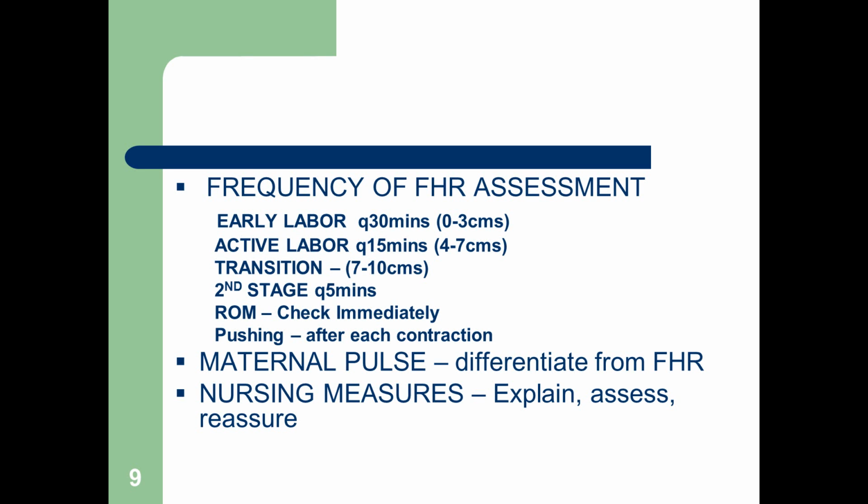But if the patient's in early labor, we're going to listen at least every 30 minutes. And if they're hooked up to the monitor, that does that for you. You just have to document that you've assessed it. Active labor, maybe every 15 minutes, and certainly in transition, more frequent. And again, if the water has broken, you're going to check the heart tones frequently. Certainly, if the water breaks, you're going to immediately check the heart tones to make sure that we still have heart tones and the baby's not getting into distress, okay?